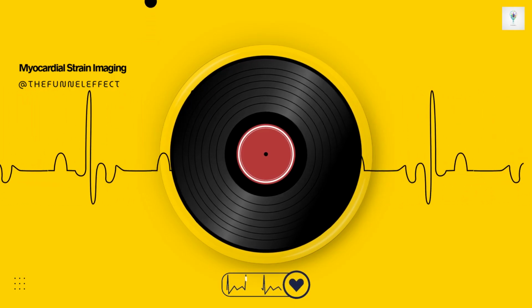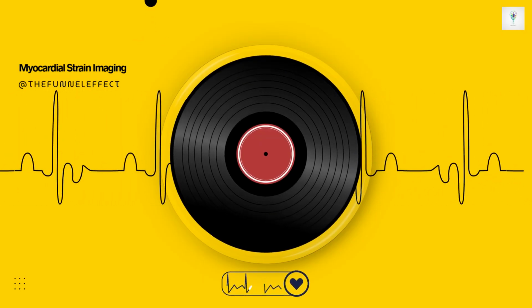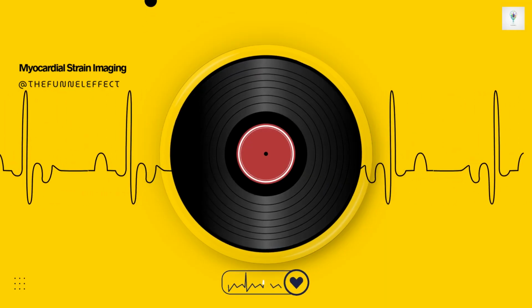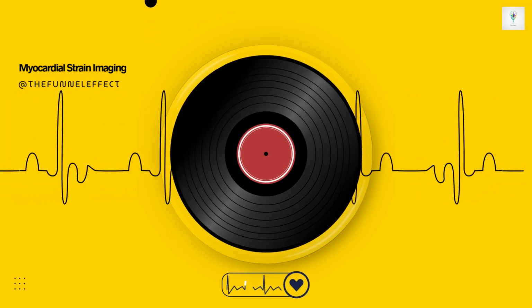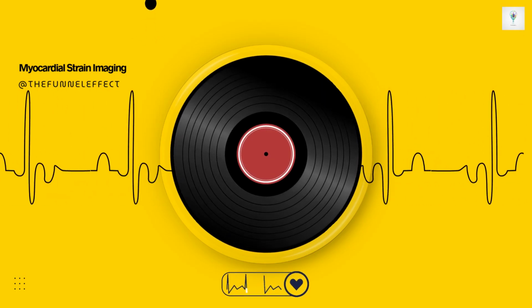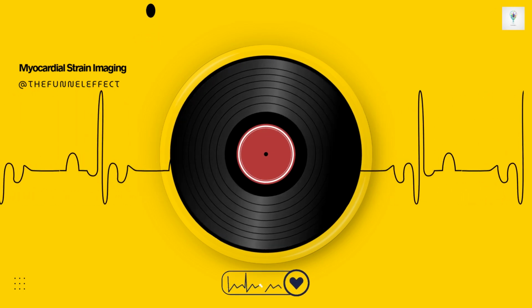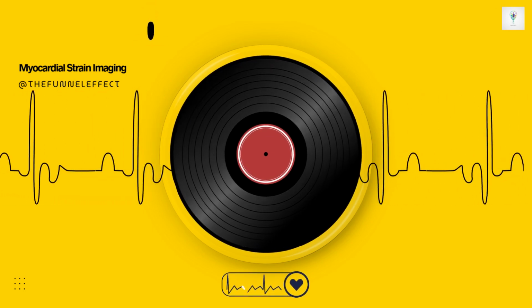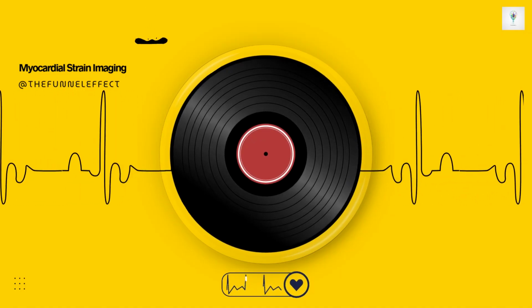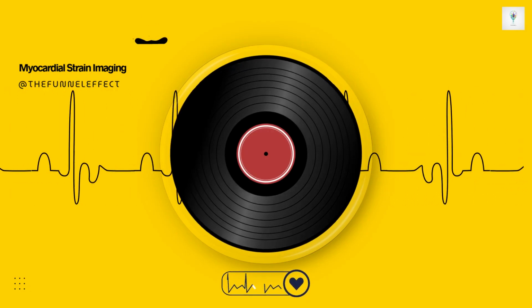How is it defined? It's defined by the peak positive strain reached by the LA wall, usually around ventricular end systole, relative to its size at end diastole, which is the zero baseline. And why is it so useful? Because the amount the LA can stretch is inversely related to the pressure inside it, which in turn reflects the pressure in the LV at the end of diastole, the filling pressure. So low LA reservoir strain suggests high filling pressures. It's also strongly correlated with LV-GLS, partly because the atrium is physically tethered to the LV at the mitral ring.